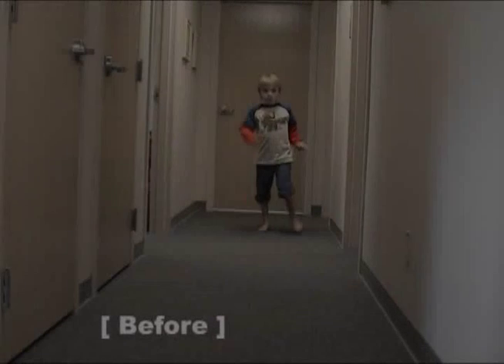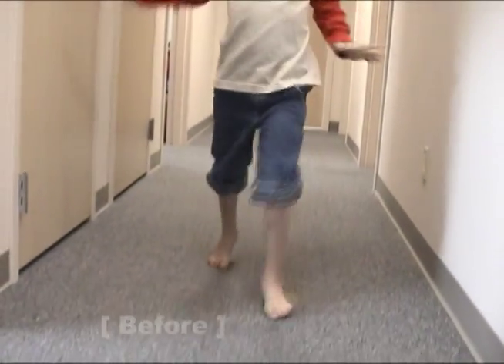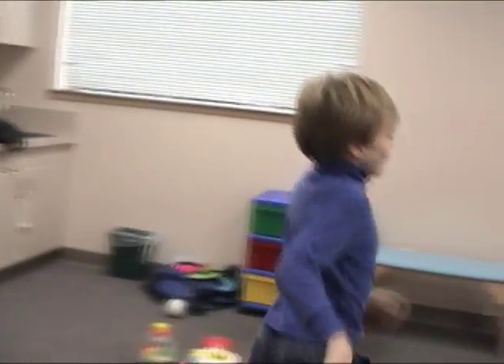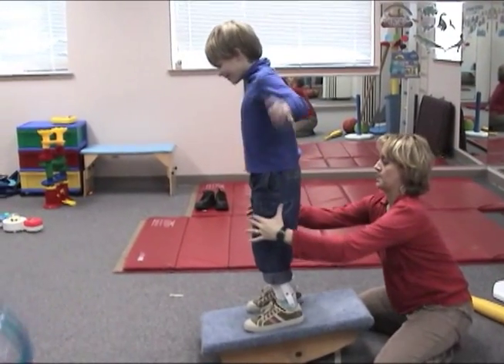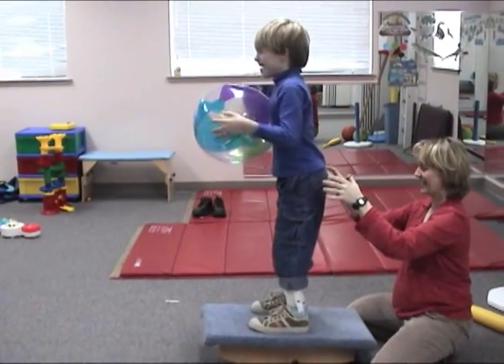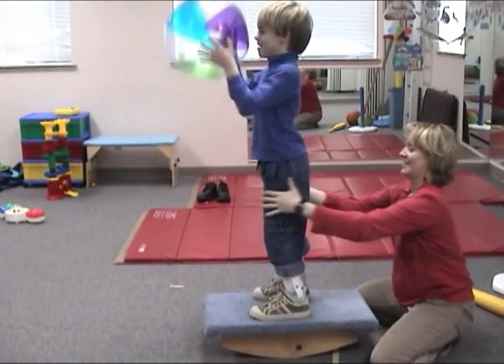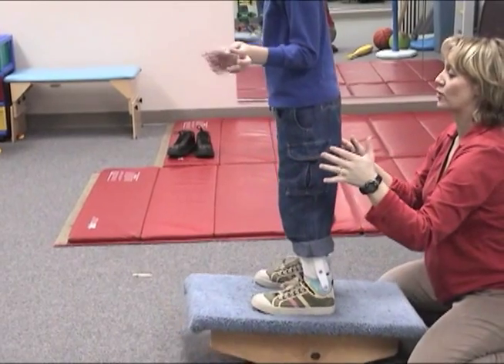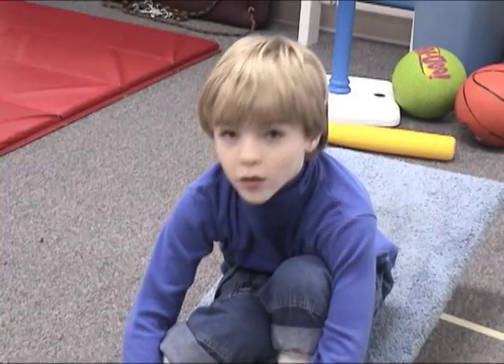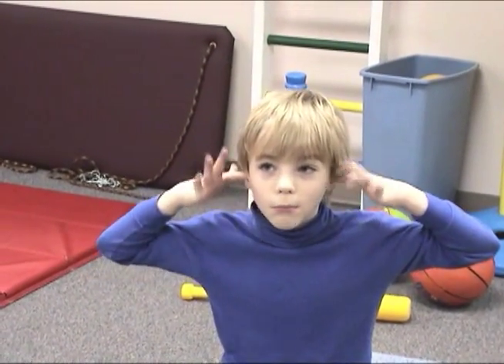To me, Adam represents one of the best before and after I've ever seen. He makes dramatic improvements in his gait. His shoulder rolling is significantly reduced. He walks smoother. The hyperextension is almost absent and he consistently uses dorsiflexion. I'm actually pleasantly surprised at how well he accommodated the control and stability offered by the number two and used it to develop gait patterns that did not require the hyperextension as a primary means of stabilizing his knee. I am extremely optimistic that these braces will match his needs for the approximately one year that this set of braces will fit somebody Adam's age.